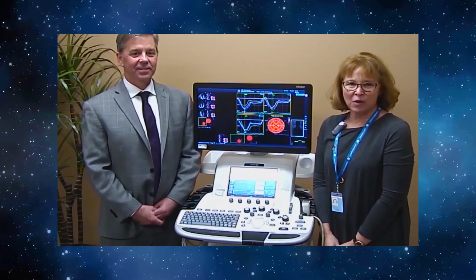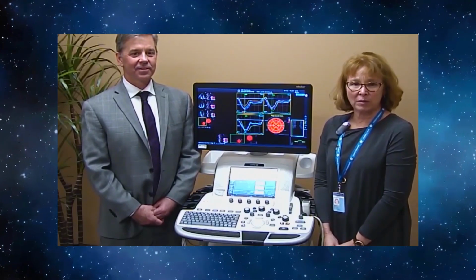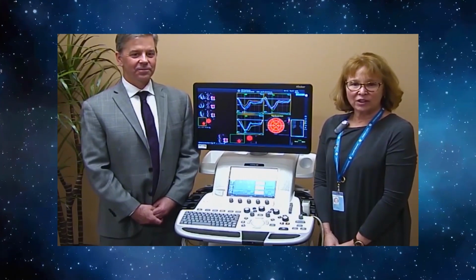I'm joining Jay Washatek here to walk you through performing cardiac strain on your LOGIQ system.